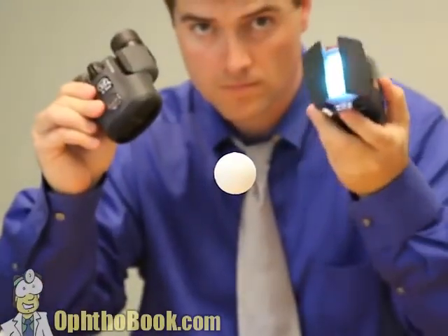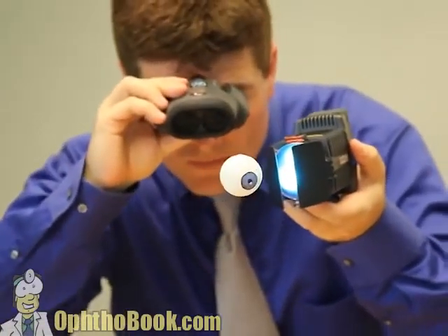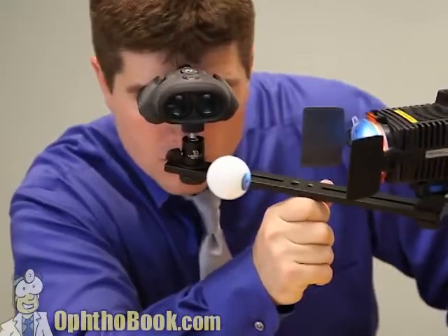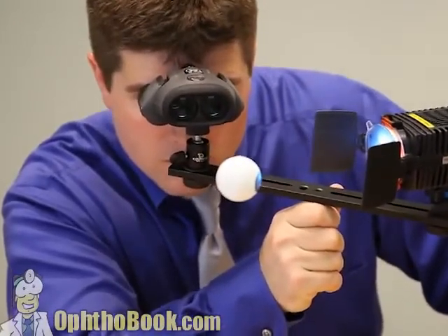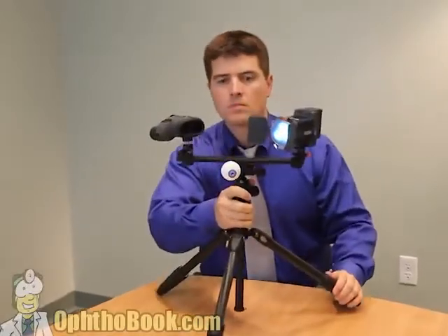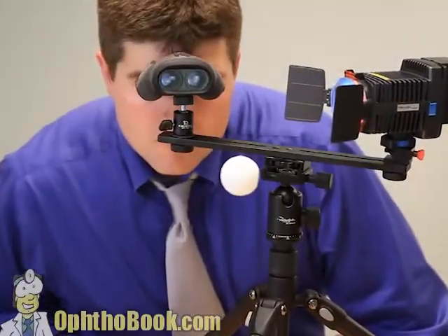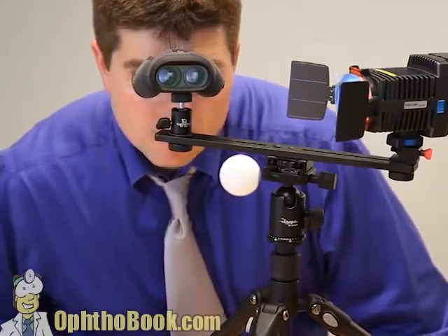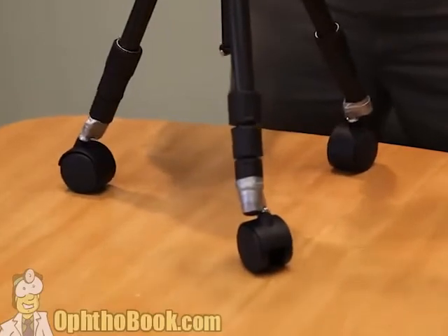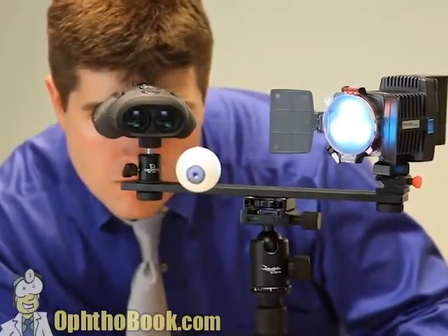So we have a perfect microscope, a perfect light source, but how do we use these things in synchrony with each other? Because it's very hard to focus them independently. Well, you can put them on a bar so that they're in focus at the same point at all times, and this works great, but it's hard to stabilize this and hold it. So let's put it on a tripod. This is much better, nice and stable, very little movement, but we can probably improve our design a little bit more by adding some type of wheels to the bottom of our tripod. And so now it moves around, and we can really move in and focus in on our eye.